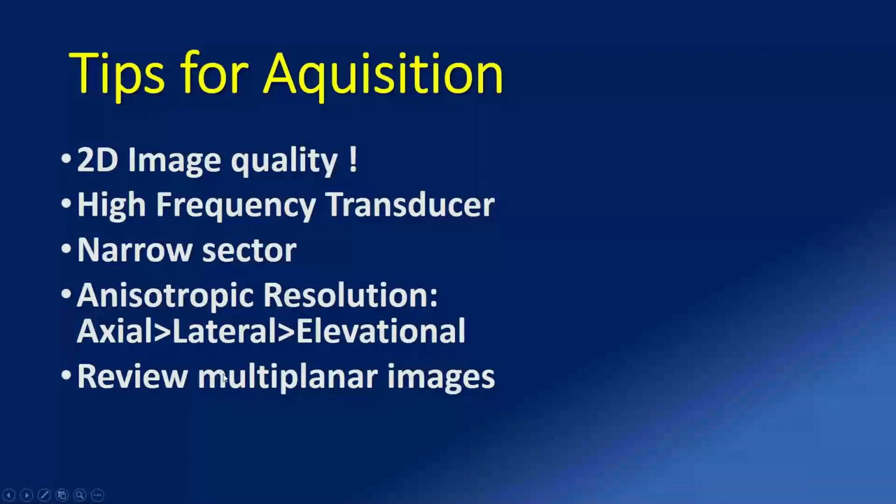And just as a suggestion, before acquiring data, it's always better to review the multiplanar images in order to be sure that all the information that we are looking for is there on the 2D multiplanar images. Otherwise, we save a huge amount of data and use a lot of space in our computer and we don't get the information that we want.